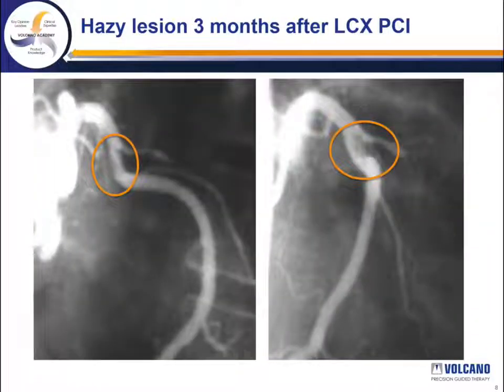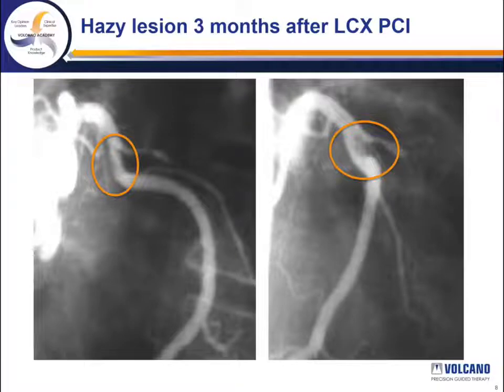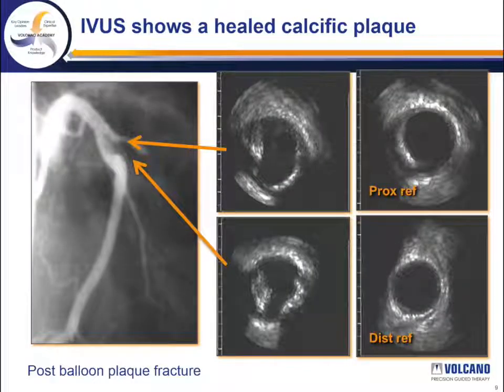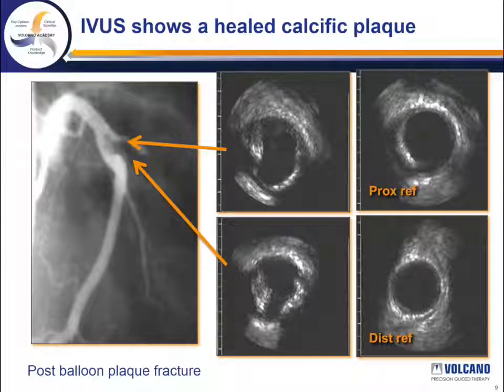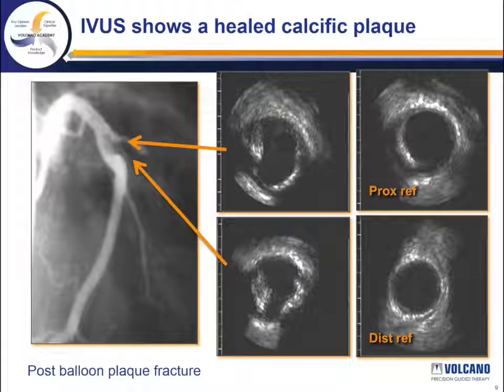Here's another patient who returns three months after balloon angioplasty of a left circumflex. There's a hazy lesion in the proximal circumflex at the site of the previous dilatation, raising the question of a PCI complication. IVUS shows a large calcified plaque that has been split during the previous intervention and is actually widely patent with no evidence of neointimal hyperplasia — essentially a post-balloon plaque fracture which has healed very nicely.